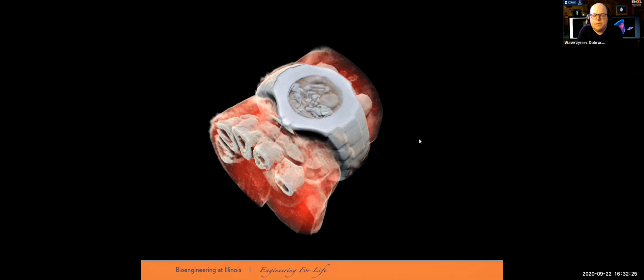The question is from Elizabeth: would high energy cause an increased risk of harm to patients or mice? Yes, that's a good question. High energy in general will cause an increased risk to patients. In terms of mice or generally experimental animals, it's not so clear. Definitely it may cause some harm, but it will be a long-term harm. If we are talking about the effects of high energy ionizing radiation, we are talking about years in the future, in the lifetime.